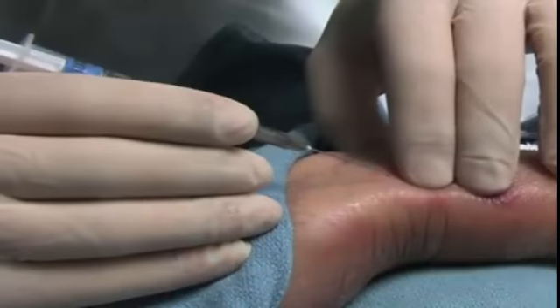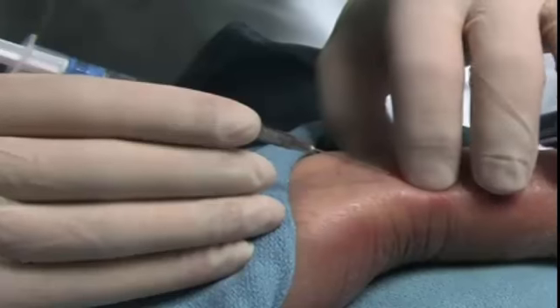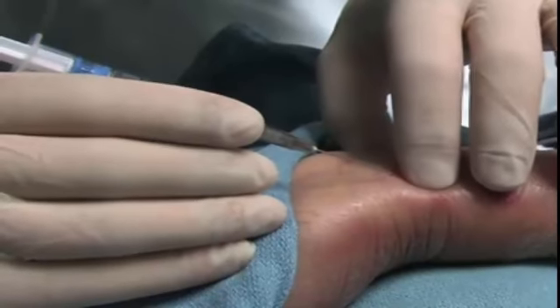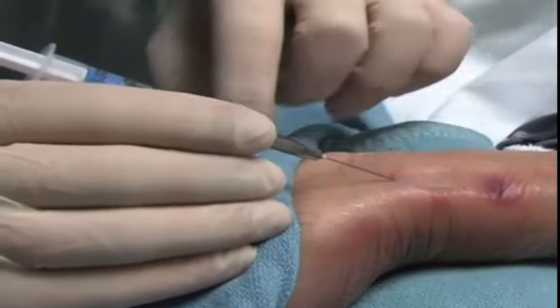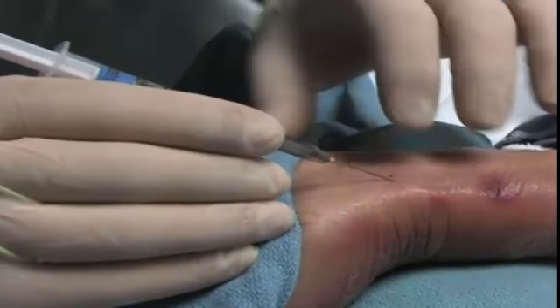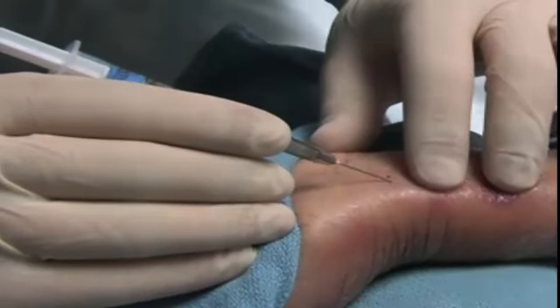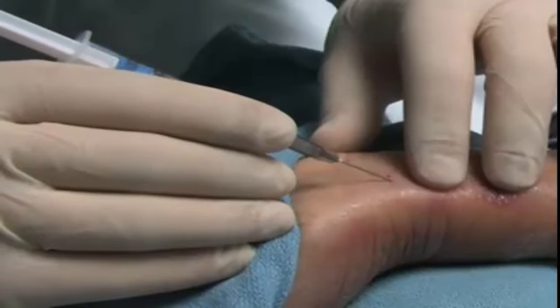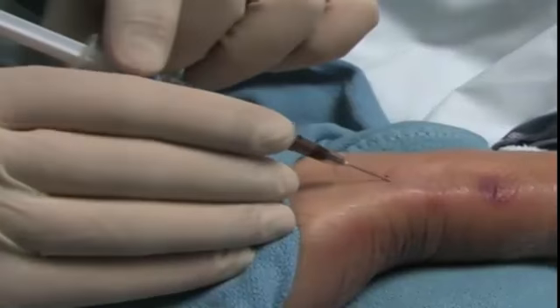Again, locate the maximum impulse with the index and middle fingers of the non-dominant hand. Holding the arterial blood gas syringe with the dominant hand, aim the needle away from the hand and toward the upper arm, and puncture the skin at a 30 to 45 degree angle at a point just below the index and middle fingers of the non-dominant hand. Advance the needle slowly until the syringe easily and passively fills with bright red pulsating blood.